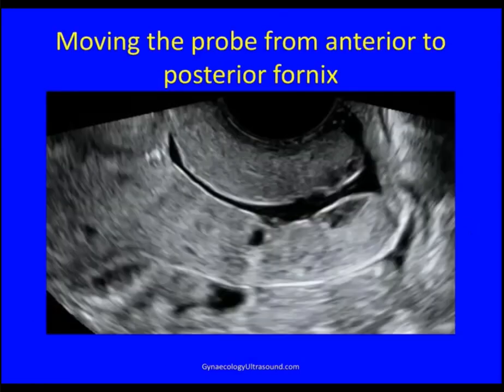How to do that? Well, when you start your scan, you will naturally end up in the anterior fornix. So the patient position is very important. Her muscles need to be relaxed to let you do this. So be sure she feels comfortable, that she trusts you, that you haven't been hurting her. Say, please let your knees go floppy and let your bottom sink into the bed.